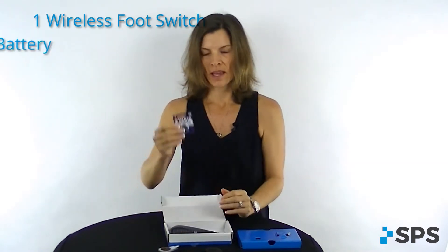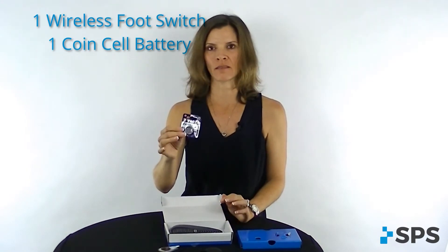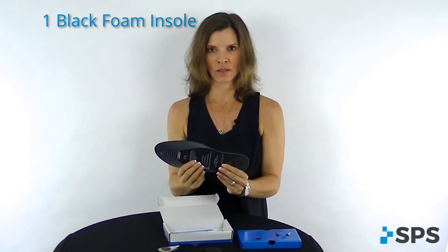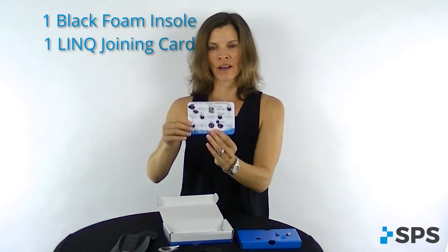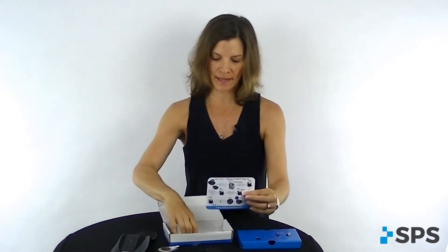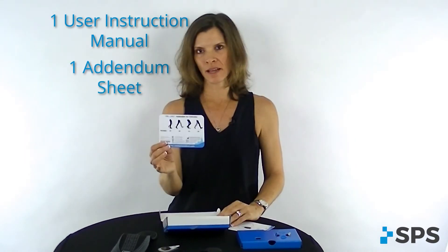You get a coin cell battery. The patient or the clinician can replace these easily at a local shop or by ordering online. You also get another foam insole for the patient to use in their shoe. Inside, you get a link joining card — this helps you with quick and easy instructions on how to pair the Bluetooth to the PaceXL unit. You'll have the user instruction manual and a quick addendum sheet for clinicians. This addendum instructs you on how to pair two foot switches through the link to the PaceXL.